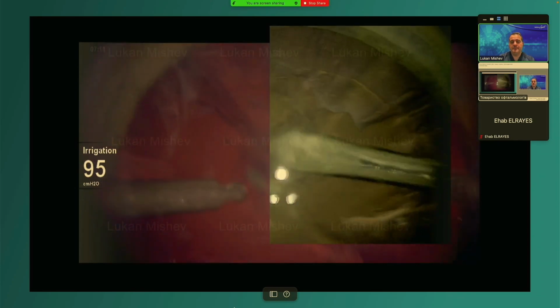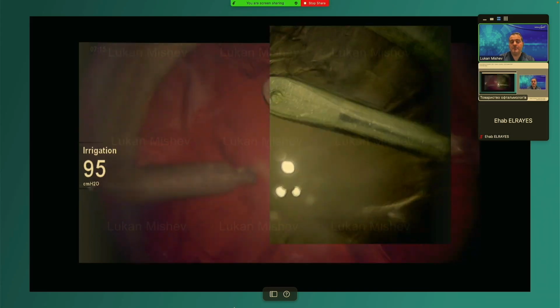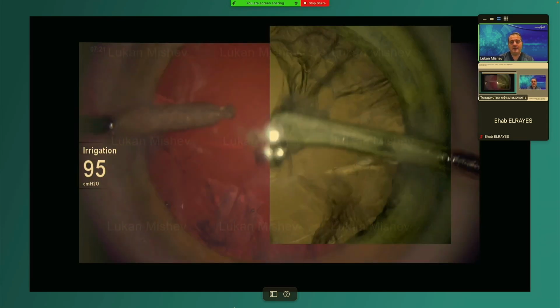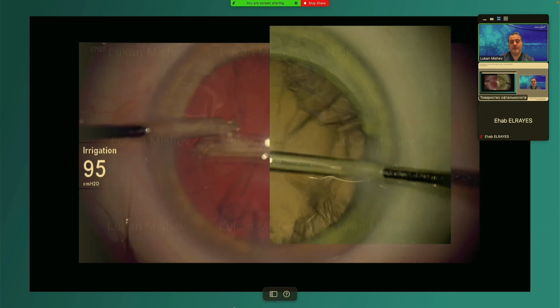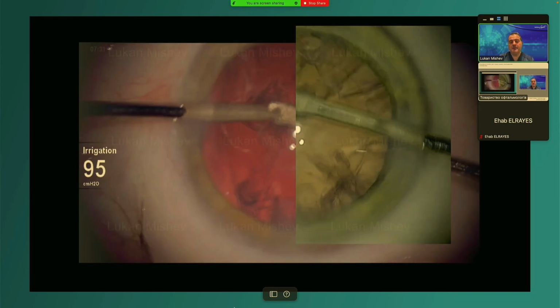So this is quite helpful in anterior segment surgery. Sometimes it's helpful in doing cataract in hemophthalmos eyes, because it enhances the fundus reflections, albeit they are somehow impaired by the existing blood there.